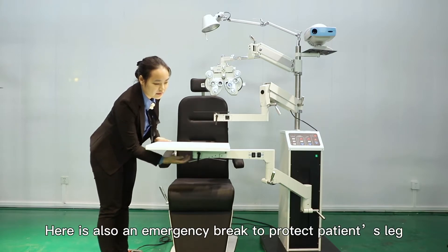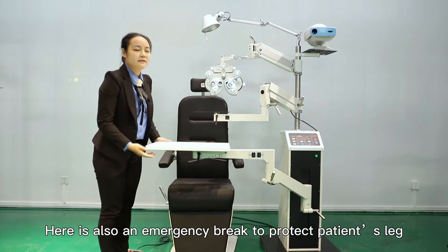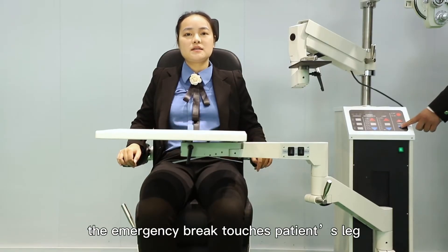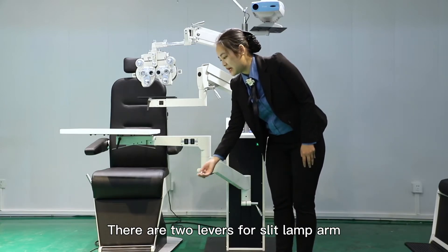Here is also an emergency brake to protect the patient's leg. While the table is going down, the emergency brake touches the patient's leg and it will stop automatically. There are two levers for the ceiling arm.